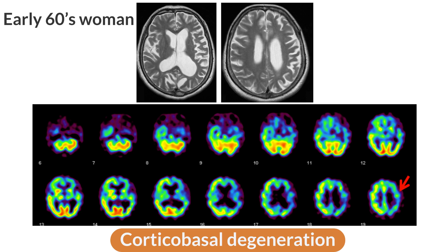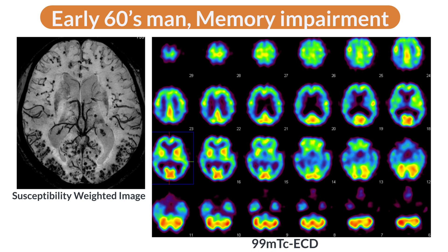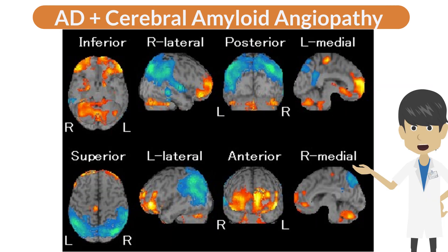In corticobasal degeneration, the left pericentral sulcus cortex — which is preserved in Alzheimer's disease — is also characterized by decreased perfusion. A case showing multiple microbleedings in the temporal and occipital lobes on susceptibility-weighted imaging with impaired memory demonstrates decreased perfusion in the temporoparietal cortex, as well as from the posterior cingulate gyrus to the precuneus — the brain perfusion pattern of Alzheimer's disease. This case is considered to be Alzheimer's disease plus cerebral amyloid angiopathy.